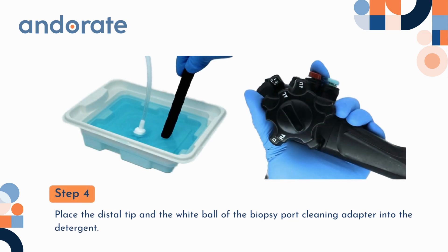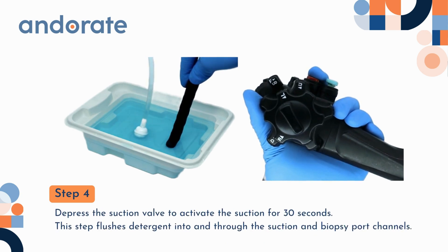Step 4. Place the distal tip and the white ball of the biopsy port cleaning adapter into the detergent. Depress the suction valve to activate the suction for 30 seconds. This step flushes detergent into and through the suction and biopsy port channels.